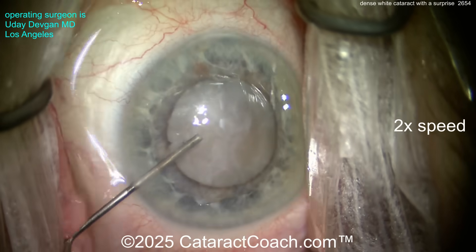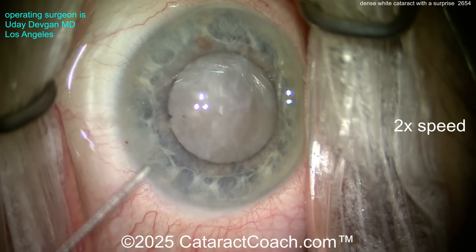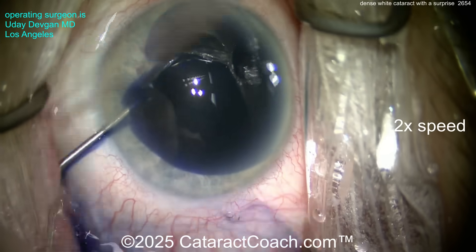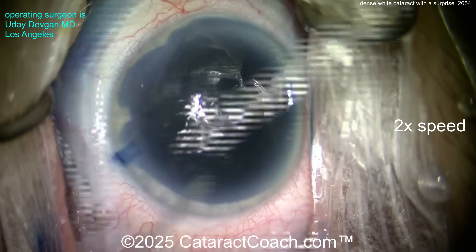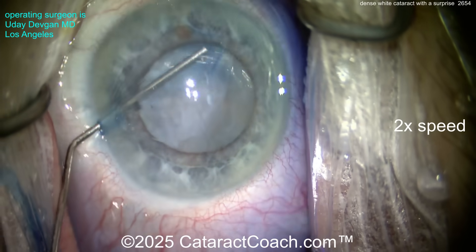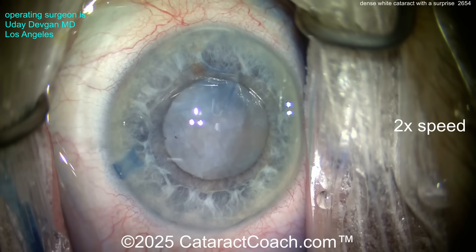Put lidocaine with epinephrine inside the eye — maybe phenylephrine, whatever you've got — and a little bit of trypan blue dye. We're not expecting any zonulopathy; everything seemed pretty normal at the slit lamp. It was a very dense cataract, so wash out that trypan blue dye. If you suspect zonulopathy, don't fill the whole anterior chamber.